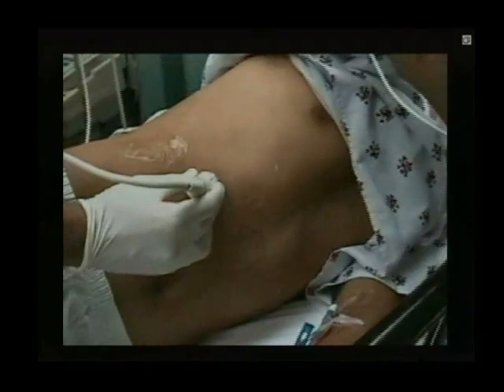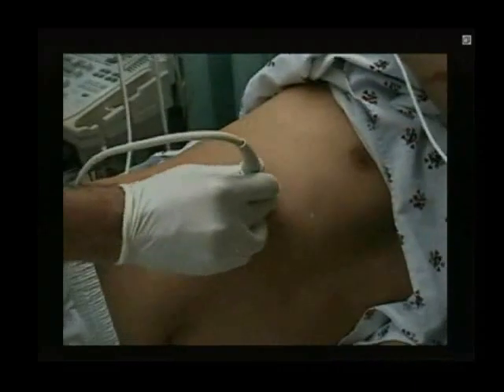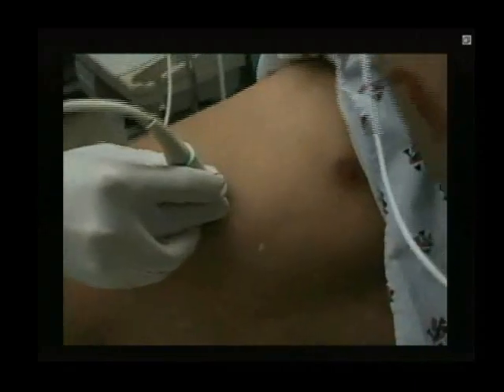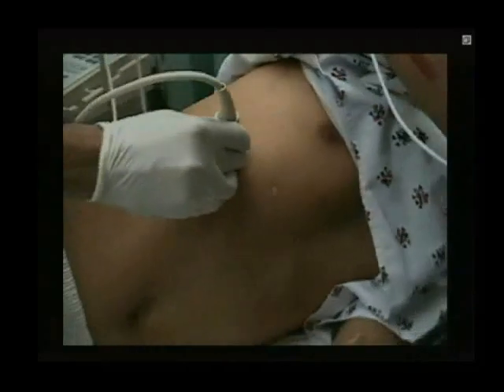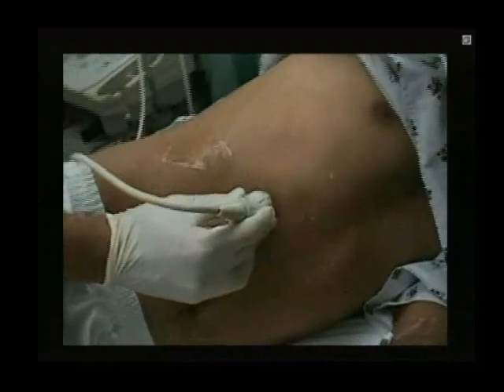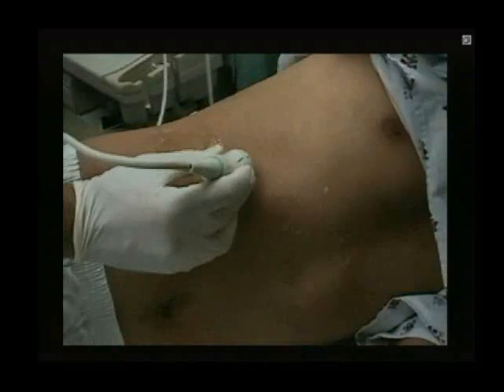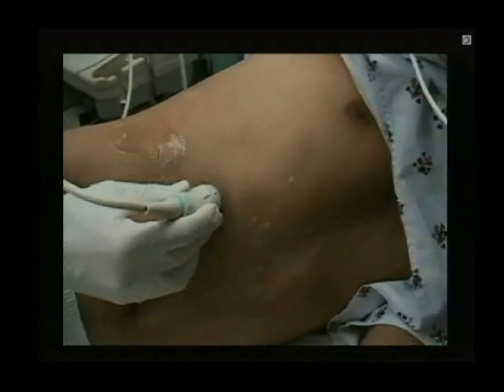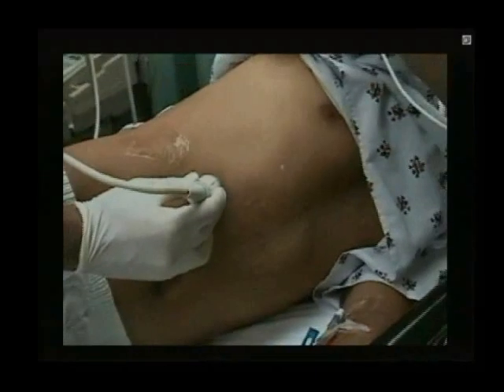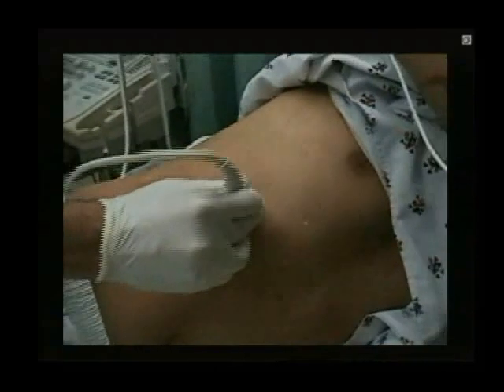If you go perpendicular to the costal margin with the marker to the right shoulder, almost all the time you'll get a pretty good view of the gallbladder. That's a great place to start. You really need to position your patient, turn to the left lateral decubitus, and you'll scan subcostally, and you'll also scan intercostally. So you'll go a little more cephalad and go through those ribs and see what you're seeing.